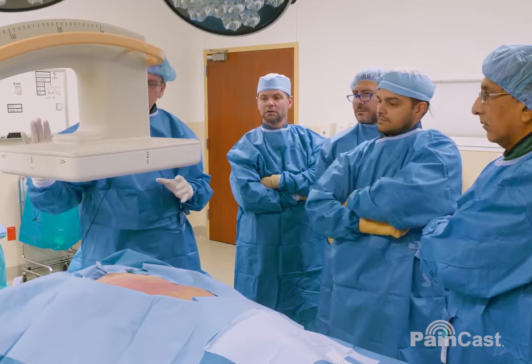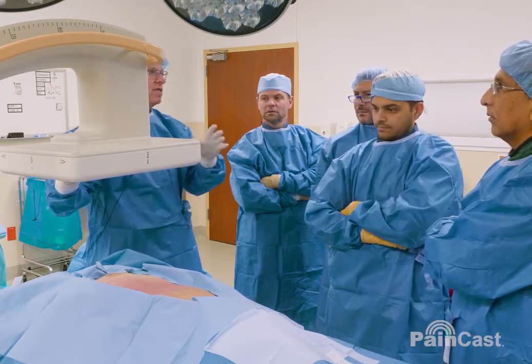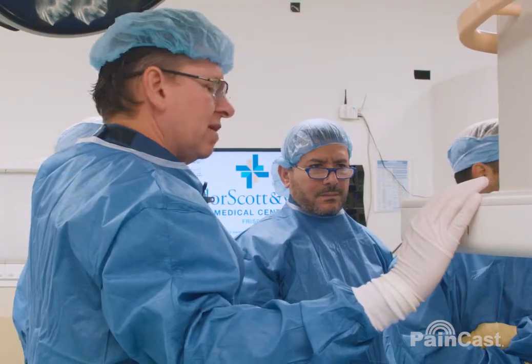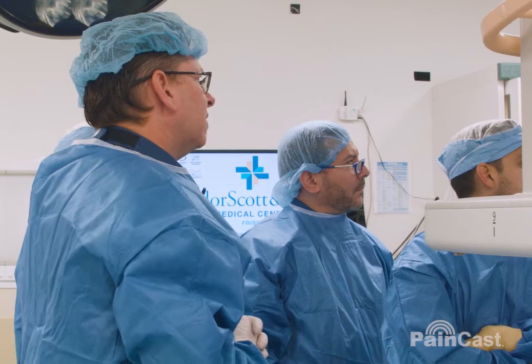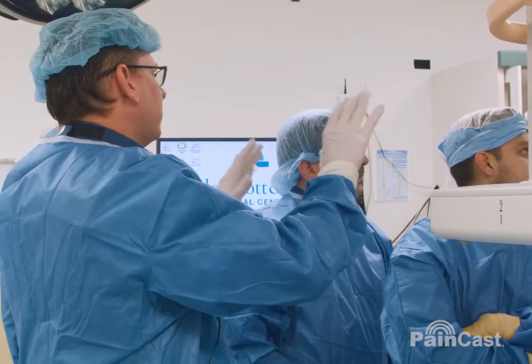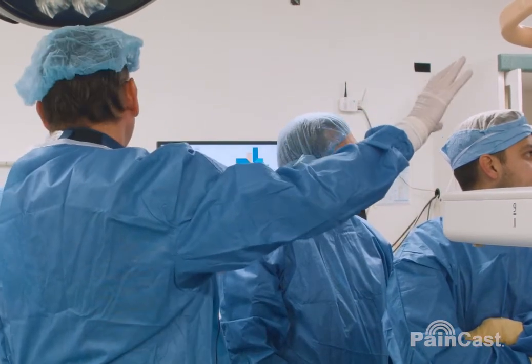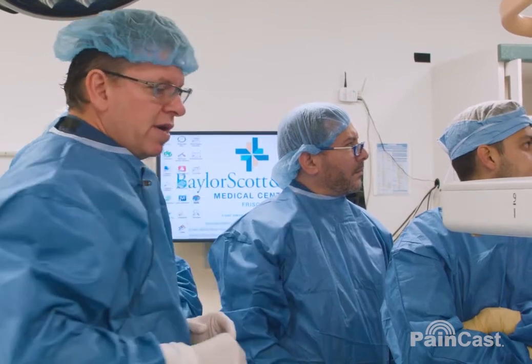Move the view up just a little bit north. I just want to see the needle tip only. Right there. So imagine we've got a defect on the right, L5S1. That's where we're going to go, right towards there.